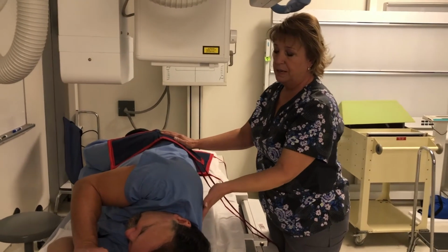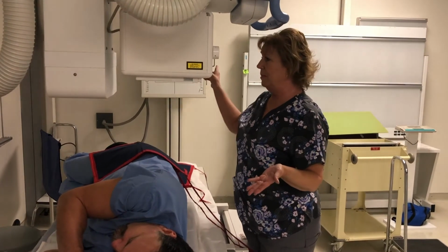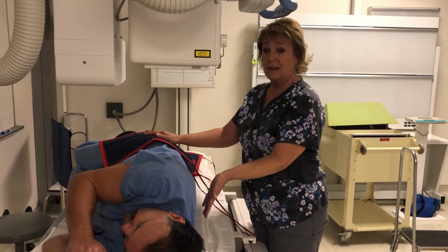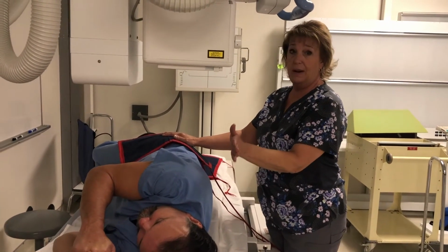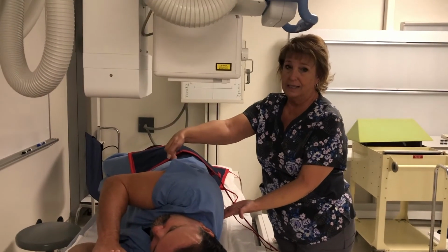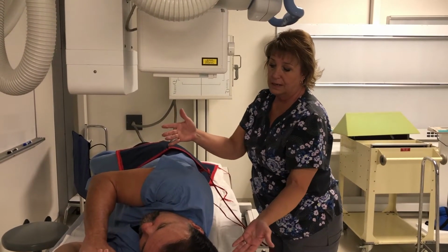Now his arm would be in the way, so I would need to bring his left arm behind him. If I was going to do PA thoracic obliques, I would probably put him in against the upright bucky. In our positioning lab and for our simulated evaluation, we're going to be doing AP obliques of the thoracic spine. I know he doesn't look very AP, but it is because he is rolled slightly off of lateral. It's entering the anterior aspect of his body and exiting the posterior. So it's still considered an AP oblique, even though he's only rolled 20 degrees.